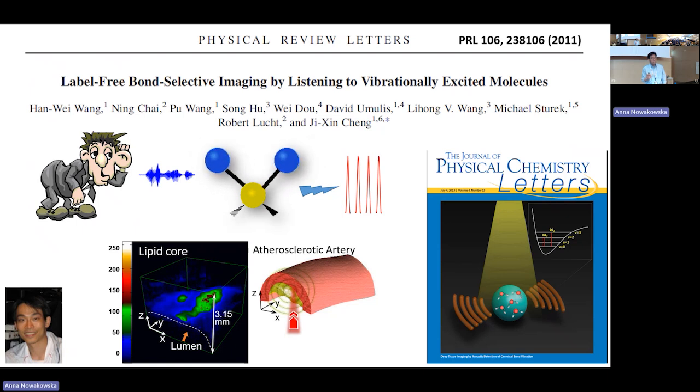This allowed us to spend another 10 years with a catheter, and then we can do in vivo imaging of lipid in this disease called atherosclerosis. Detection of this vulnerable plaque is still a holy grail of the field because that's the number 1 killer of the United States.